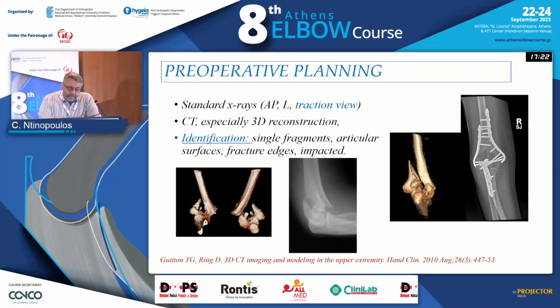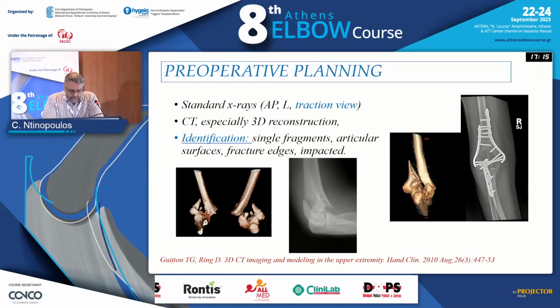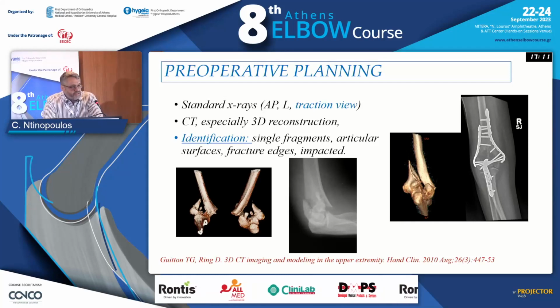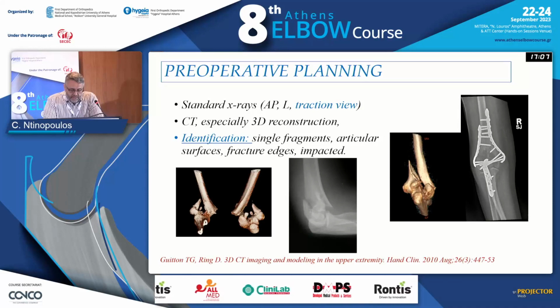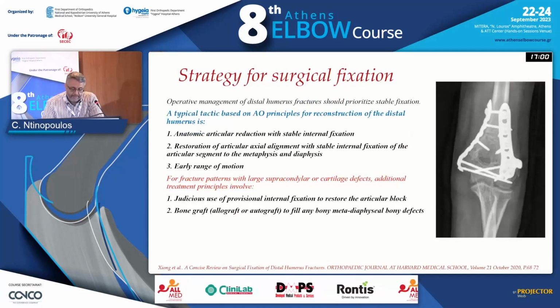Preoperative planning: usual X-rays, CT scan, 3D reconstruction. We have to identify single fragments, surfaces, spikes, edges, what is impacted, and just to remind you, the traction view gives extra information through a simple X-ray as well.